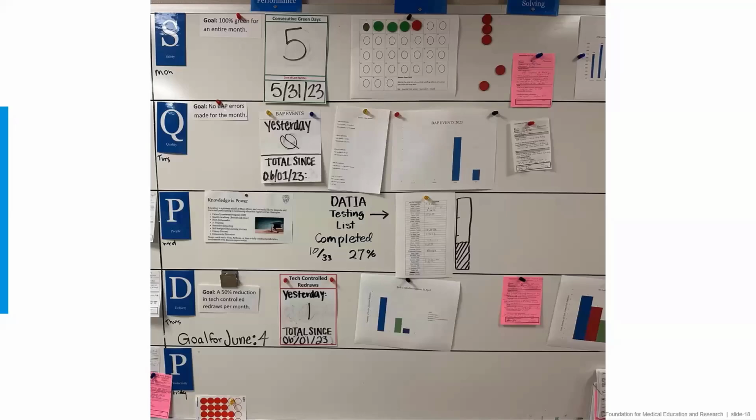So this is a real life example of an MDI board. We have this in most of our phlebotomy areas, and we have huddles every day, sometimes multiple times a day, because some of the techs come in at different times of the day, so we cover everybody in the lab. But the key is you have to start it and maintain it.